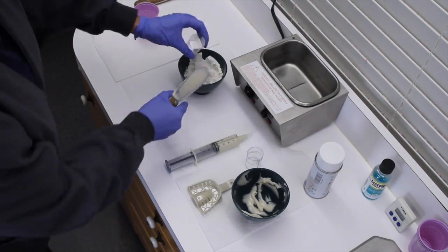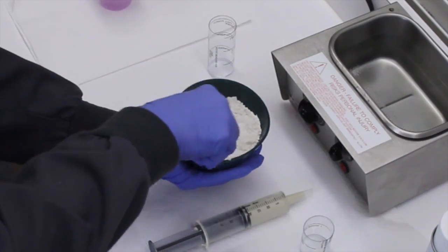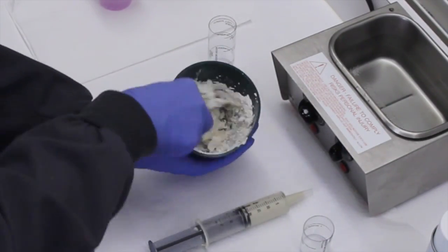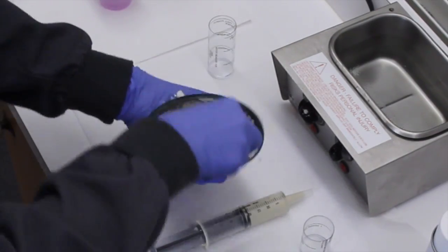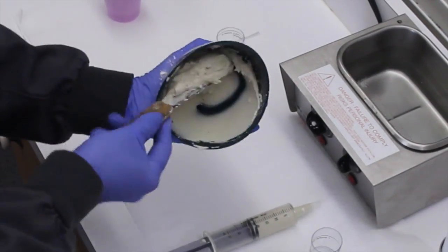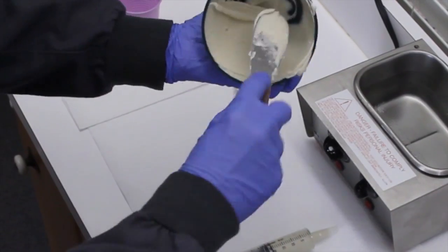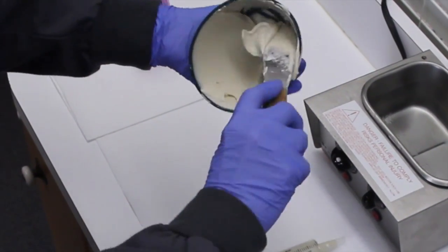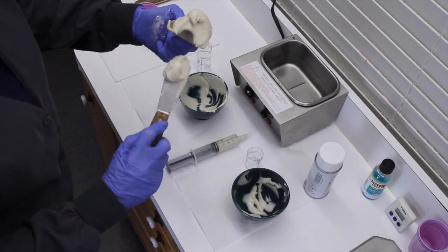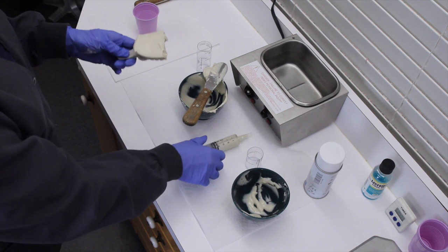And again, the high viscosity alginate will be loaded into the tray. Having a nice smooth mixture here is very important. And again, using the same consistent water powder ratios produces a very consistent and very predictable mix, a very consistent viscosity, and the temperature produces a very consistent, good working time, good setting time. So she will then load the tray, and we are now ready for insertion into the patient's mouth.